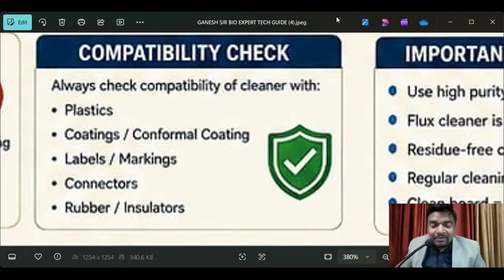Technically, why? If you take a ventilator's main board, like the motherboard, what actually happens is the resistor, capacitor, and MOSFET get damaged and blast. You have to replace those components, and how much do they cost? Very little compared to the spare part.